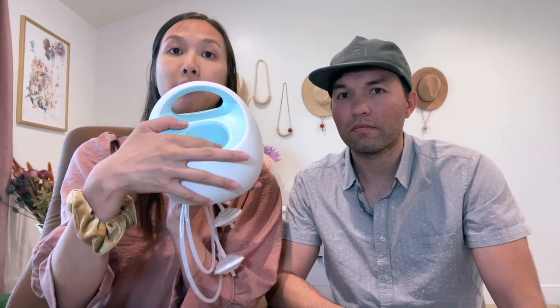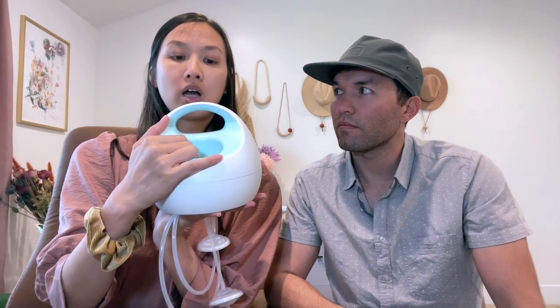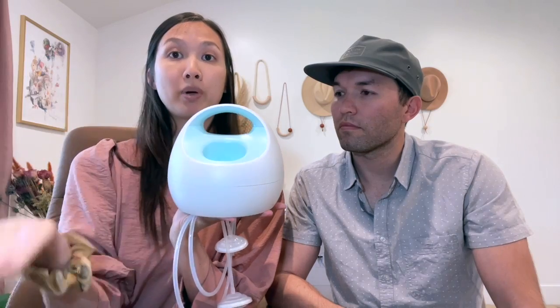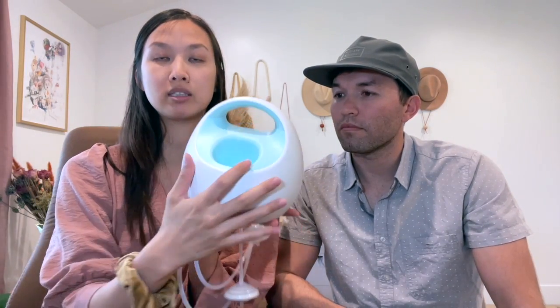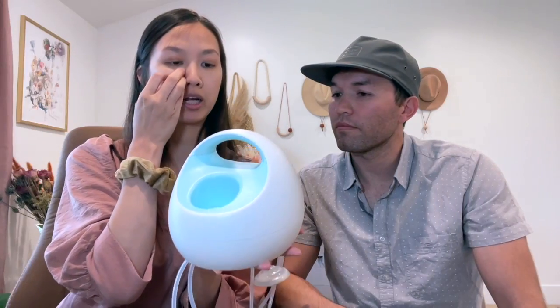It's pretty easy. You have buttons here to alter the cycle and the vacuum. It has a nice light feature, so at nighttime if you need that, it's there. It has a compartment for your drink because part of breastfeeding, they keep up your supply, and you really want to stay hydrated. So it's a nice compartment for you to put something there.